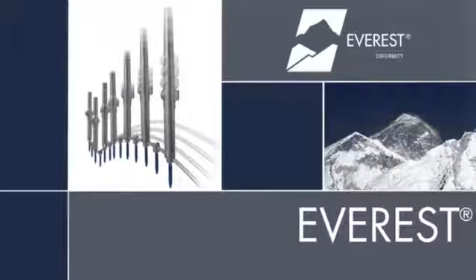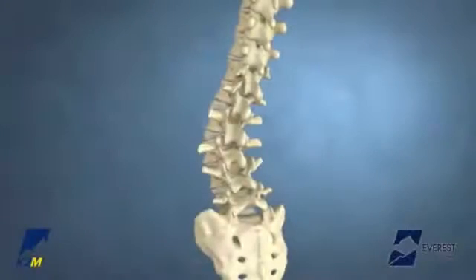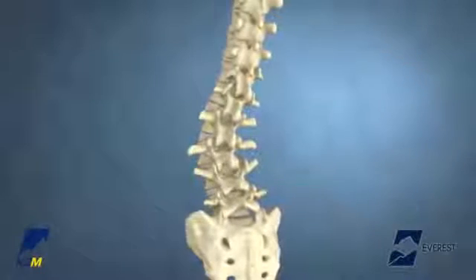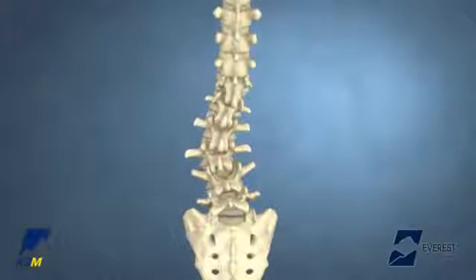Introducing the Everest Deformity Spinal System from K2M, Complex Spine Innovations. This animation demonstrates an adult lumbar deformity correction using K2M's Everest Platform Pedicle Screw Technology.